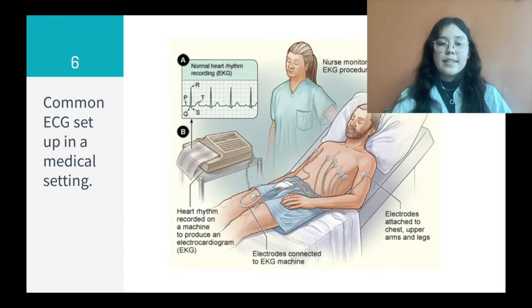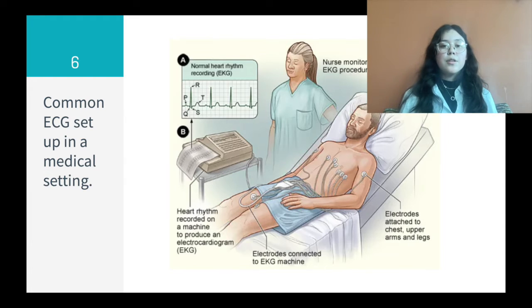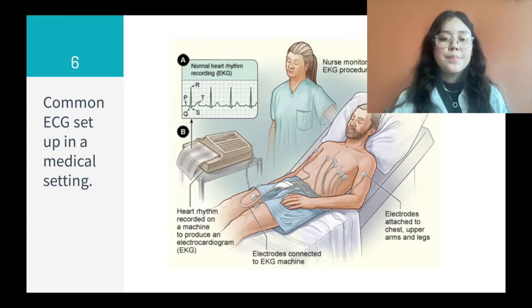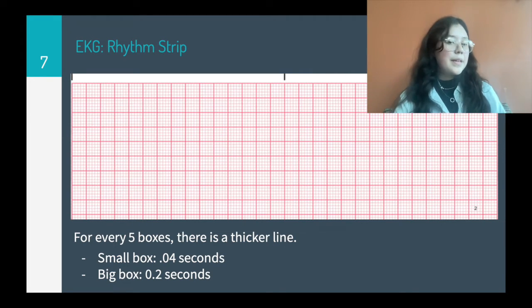But Thoracic Key explains the different positioning for the leads, as different places detect the voltages of different currents conducted in the different locations, and abnormalities in these locations may suggest damage to certain parts of the heart. So they go all around the chest, they go on the legs and on the arms as the leads go there. So now that we know how to place leads and the physiology of the heart, we can move on to the basics of an EKG strip.